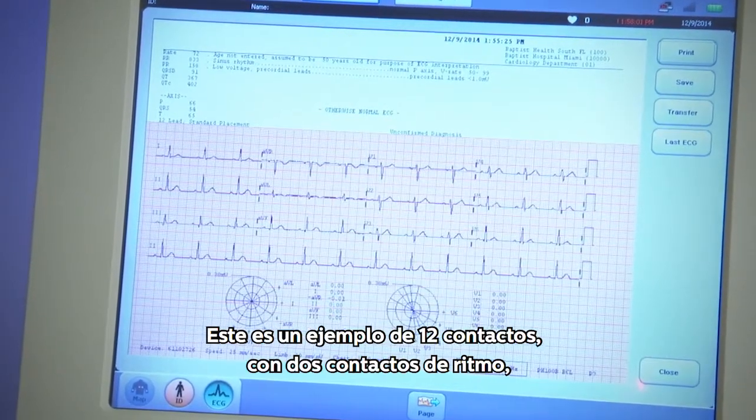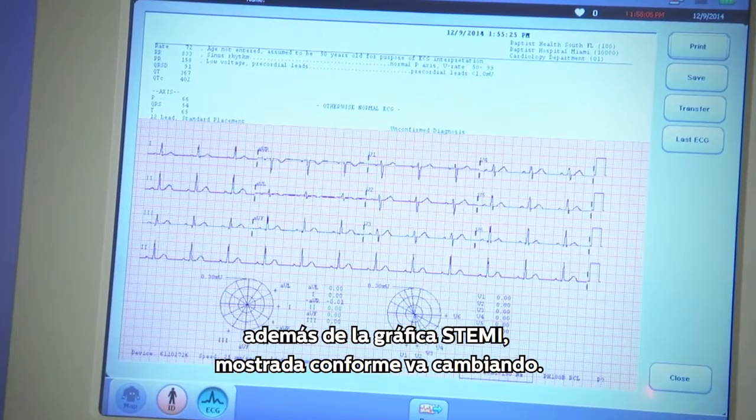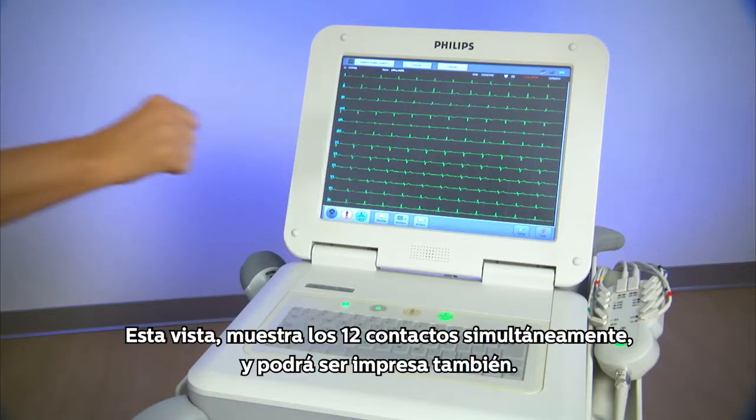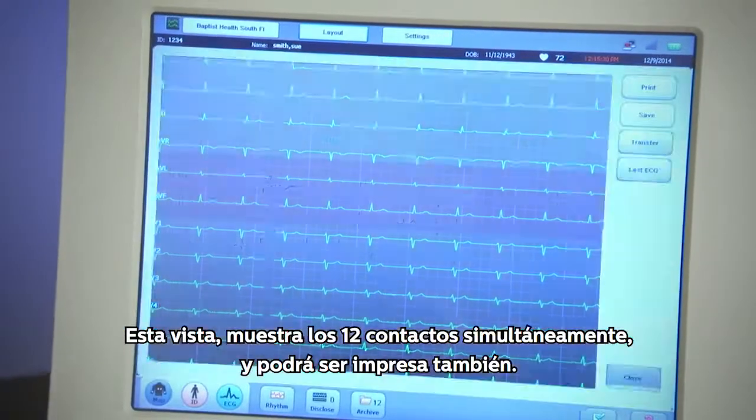This is an example of the 12-lead with lead 2 rhythm along with the ST maps graphically showing ST changes. This view shows all 12 leads simultaneously and may be printed as well.